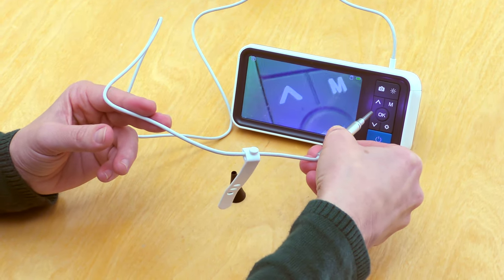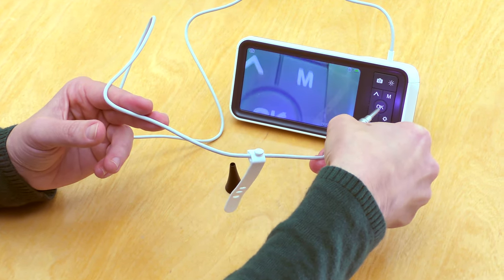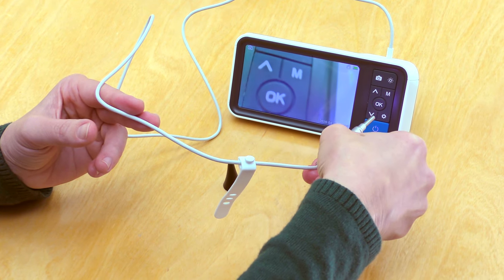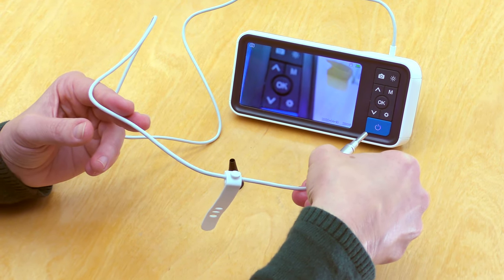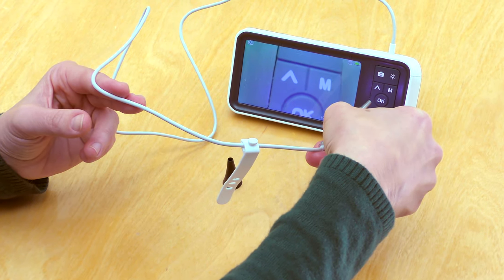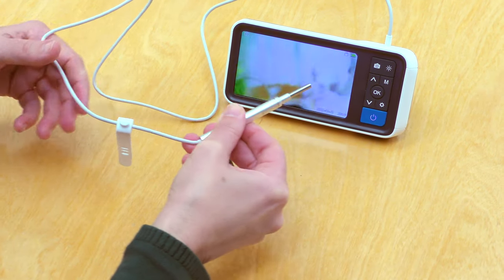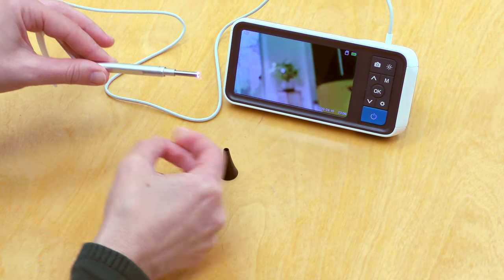First, make sure the camera is oriented so that you know which way is up. Digital otoscopes have a fixed focal length of about 2 to 3 centimeters, so if the camera is positioned too far away, the video image will go out of focus, as you can see here. The diameter of the camera itself is about 3.9 millimeters with a viewing angle of 70 degrees and a depth of field of 20 to 30 millimeters.